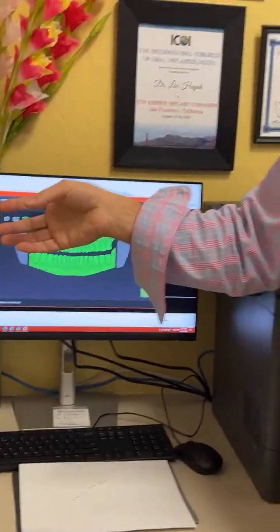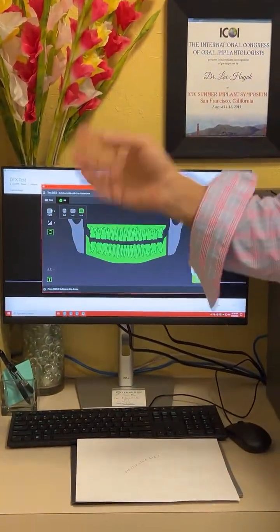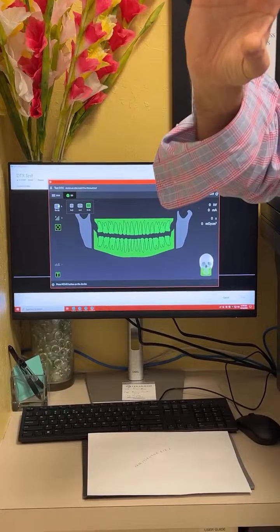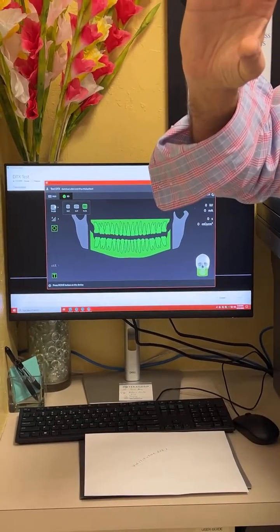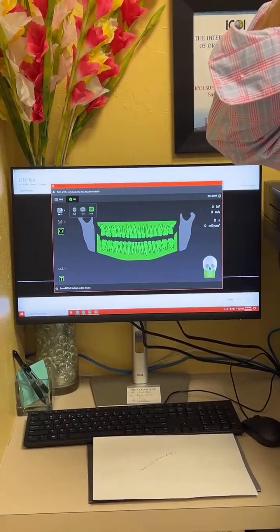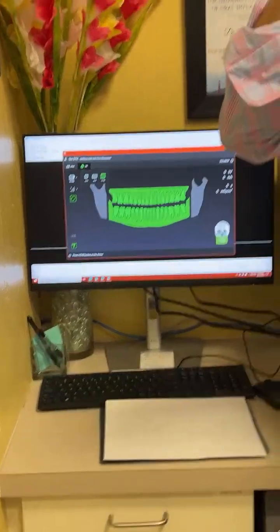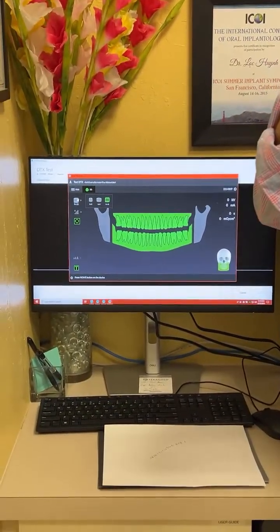The beautiful thing is, you guys are only gonna take what you need. The opposite is true. If you went to a 6x9 and you look at that and go, 6 is too high, what am I capturing all that height for? Or 9x11, I thought that was perfect, but that's too much. I can drop it to an 8, 7, 6, or 5x11.